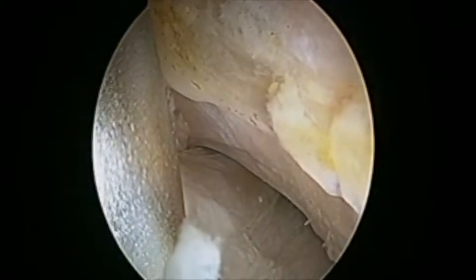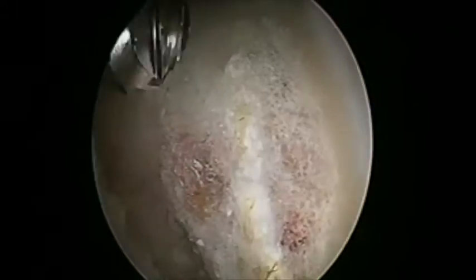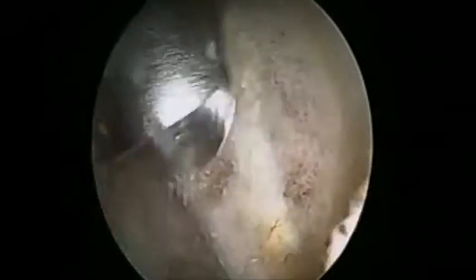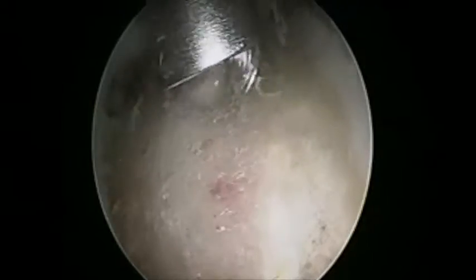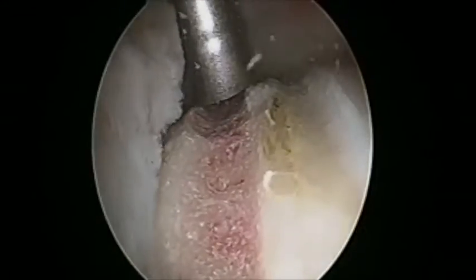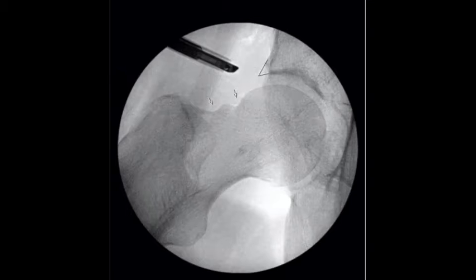In doing so, it is important to identify the lateral retinacular vessels and ensure their safety during the resection. Resection then proceeds at the location previously identified as 1.5 burr lengths distal to the articular surface. Tier 1 resection continues until appropriate depth as well as restoration of head and neck offset is achieved. This is confirmed with fluoroscopy.